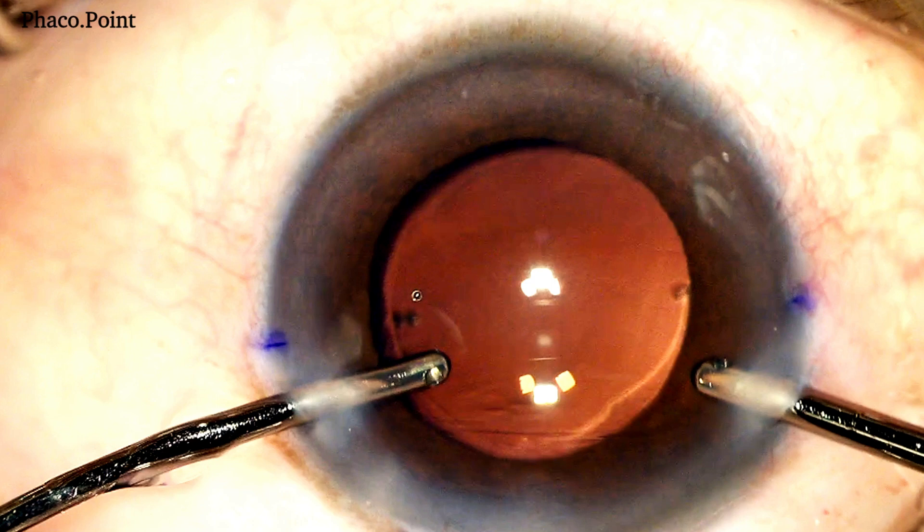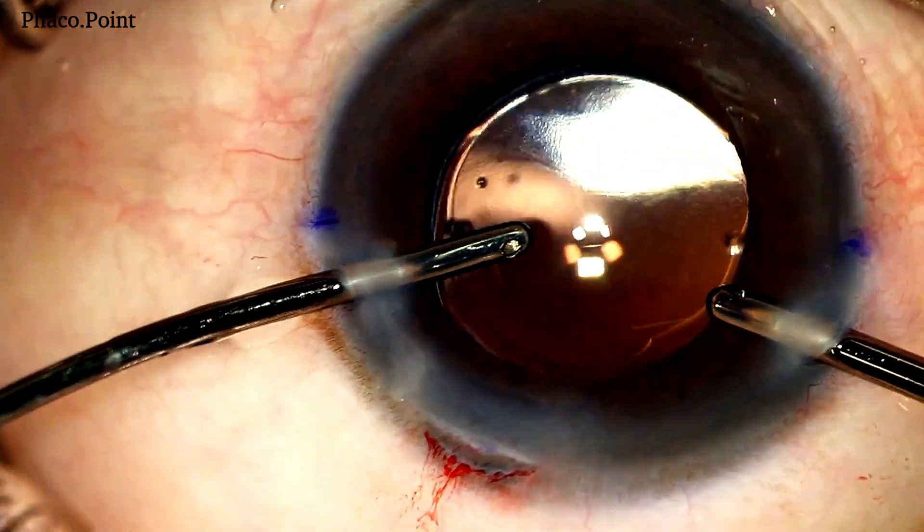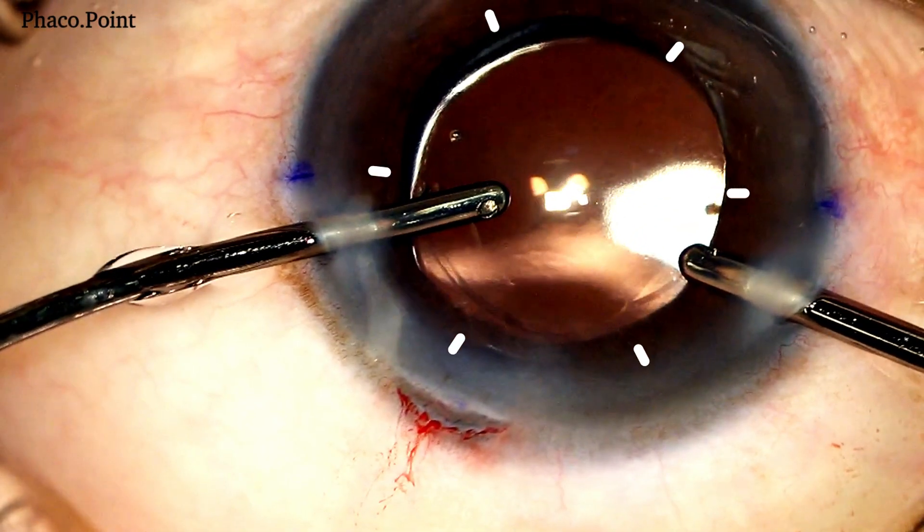Let's now see what it looks like when we superimpose these two images. As we straighten the eye, we can see how the first and the fourth images are completely superimposed. This signifies a perfect alignment of the eye in the visual axis.